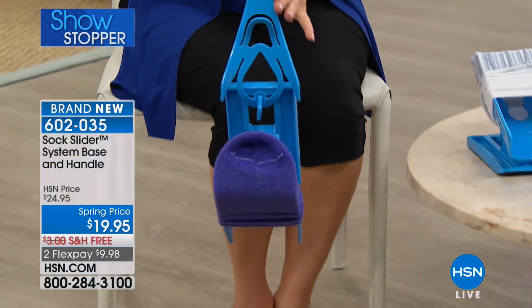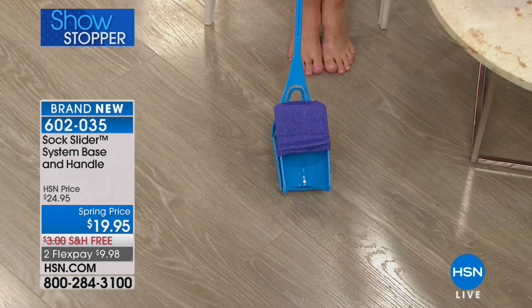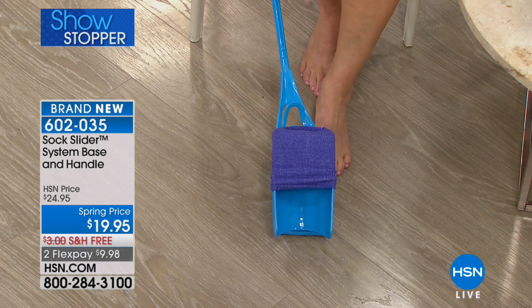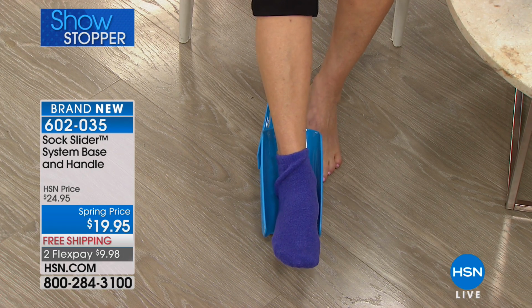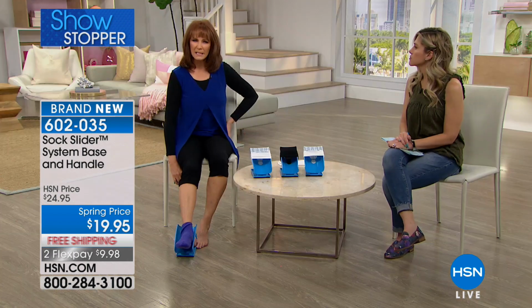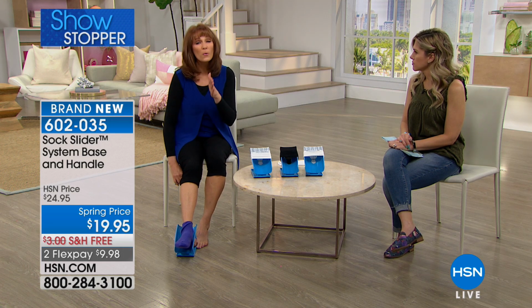So here's the handle that comes with it. I put on the sock, I drop it down on the floor, all while I'm sitting on the bed or in a chair, and then I can keep this handle on it to steady it if I want, and then boom, I'm in my sock, and I did not bend over. I was obedient to the doctor's orders. I didn't bend at the hip, I didn't bend at the top, and I was able to get in my socks. What a relief.